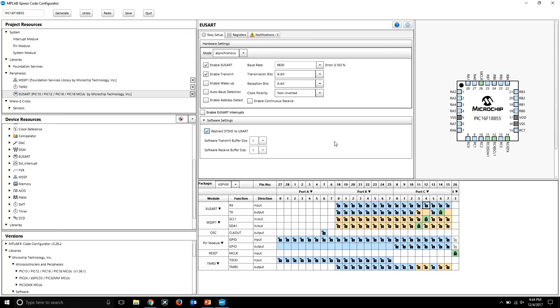Now we have done the EUSART module setup, but once again, we have to tell MCC which pin the EUSART module will be using. Now we're going to find that out. Once again, you can go back to the data sheet that we have, or check out the schematic.